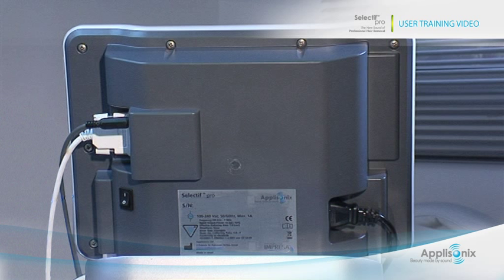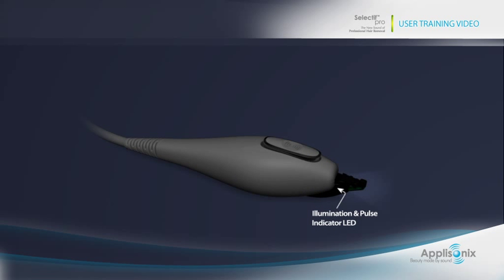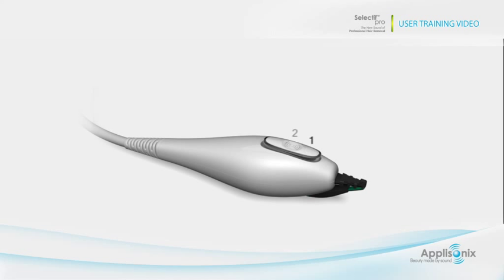Now let's take a look at the probe. These are the two gripping tips that grab the hair and transmit the ultrasound wave. Between them, there is an illumination and pulse indicator that lights the treated area and flashes with the ultrasonic pulse. The light may be switched off and on by pressing the mute button for three seconds. The multi-purpose button is easy to use in a 1-2-3 operation. One: to open the gripping tips, press the front.